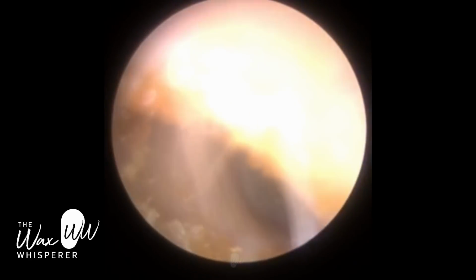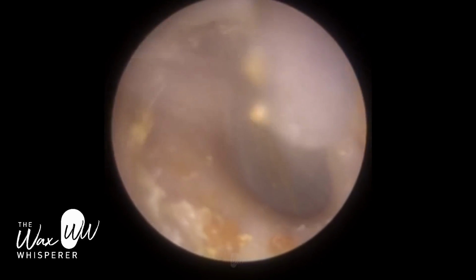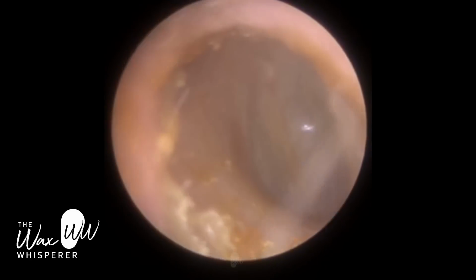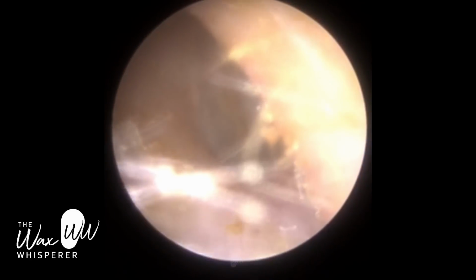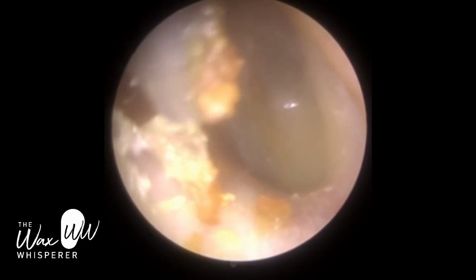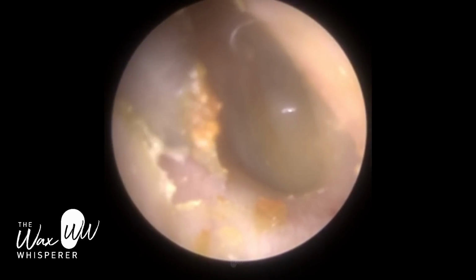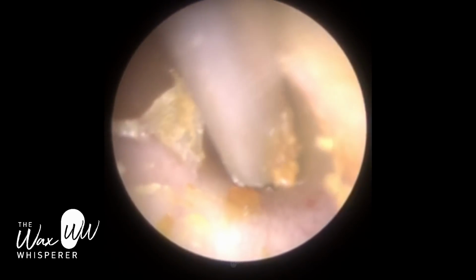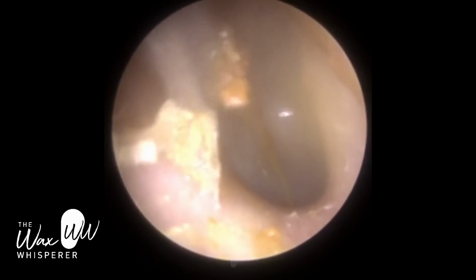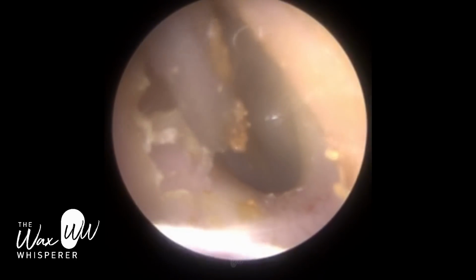You can see the eardrum in the distance. This patient's ear canal, everyone's ears are oval shaped, so with the height being greater than the width, but this patient's ear canal is a bit more slit, a bit more narrow, a bit more oblique, with the ratio between the height and width being greater, so it gives you this kind of more elongated view. Just some dead keratin on the base. It's not really significant. If I do remove that, it's not going to improve the patient's symptoms, but it was loose, so I just thought let me just use a fine end tip, see if I can remove that.